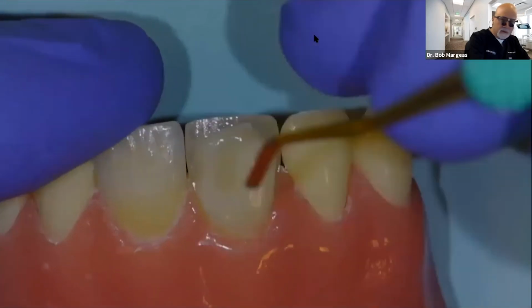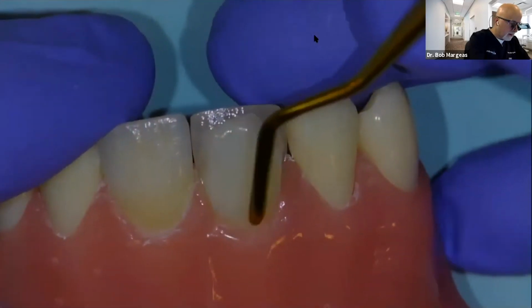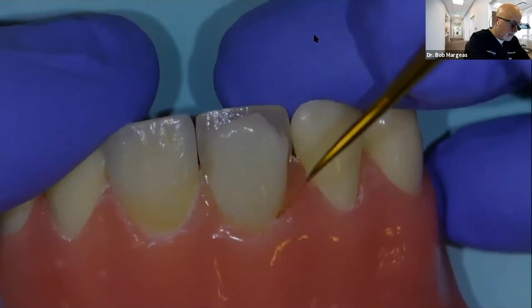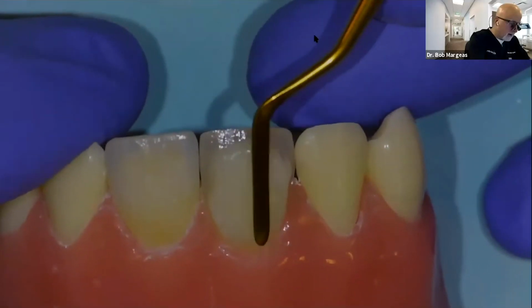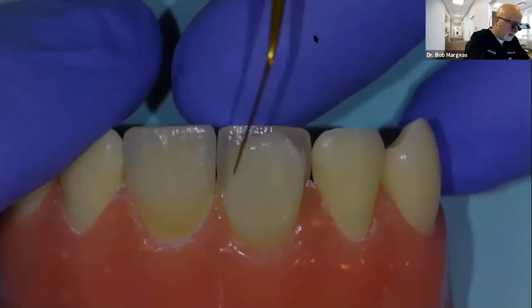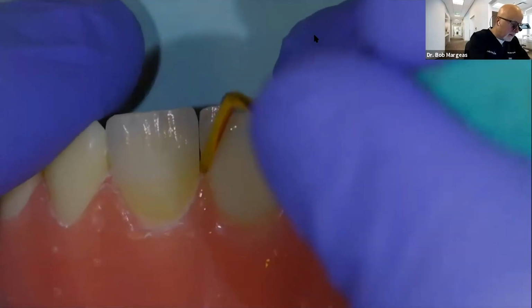Okay? So what I want to do is adapt this as well as possible to the cervical, making sure that I have all my margins covered. And then I'm going to bring it down to the incisal edge and cleave it off.